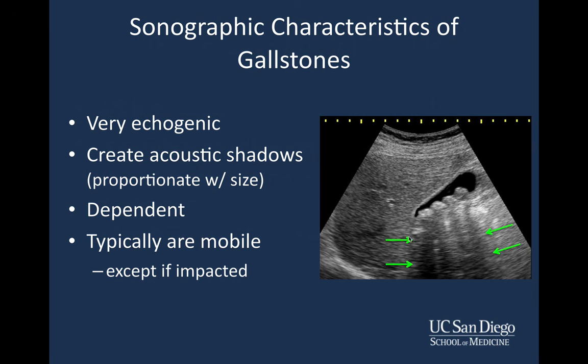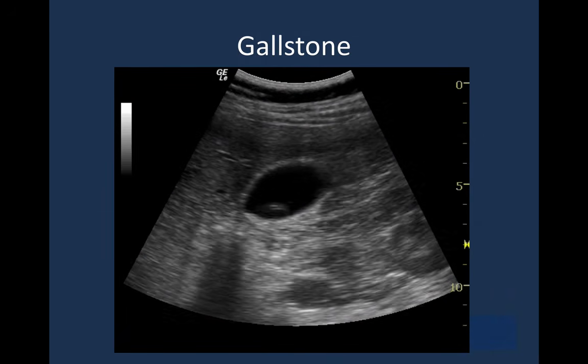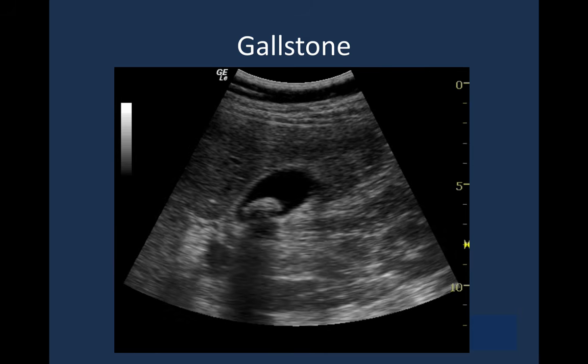Here you can see we've outlined the degree of acoustic shadowing in this particular gallbladder that is literally filled with gallstones. So here's a video clip demonstrating a single mobile gallstone with typical acoustic shadowing.